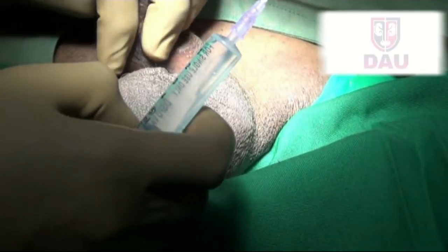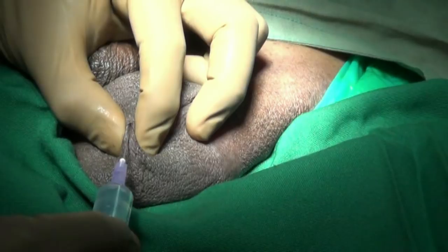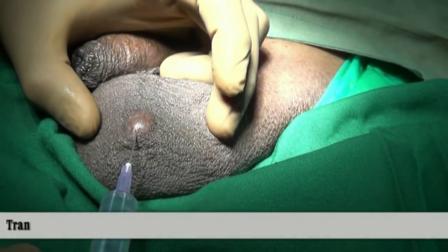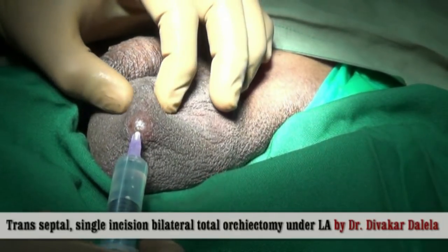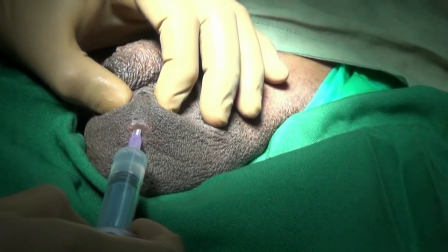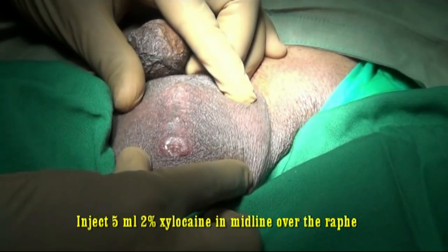Let's first inject 2% lignocaine in the midline raphe. This is the midline raphe — first put the needle here and as you inject you will see raising a wheal. This injection is essentially intradermal and partly subdermal. Advance in the dermal plane and also in the subdermal plane; part of the lignocaine will go in the septal area. About an area of an inch and a half is injected with lignocaine.